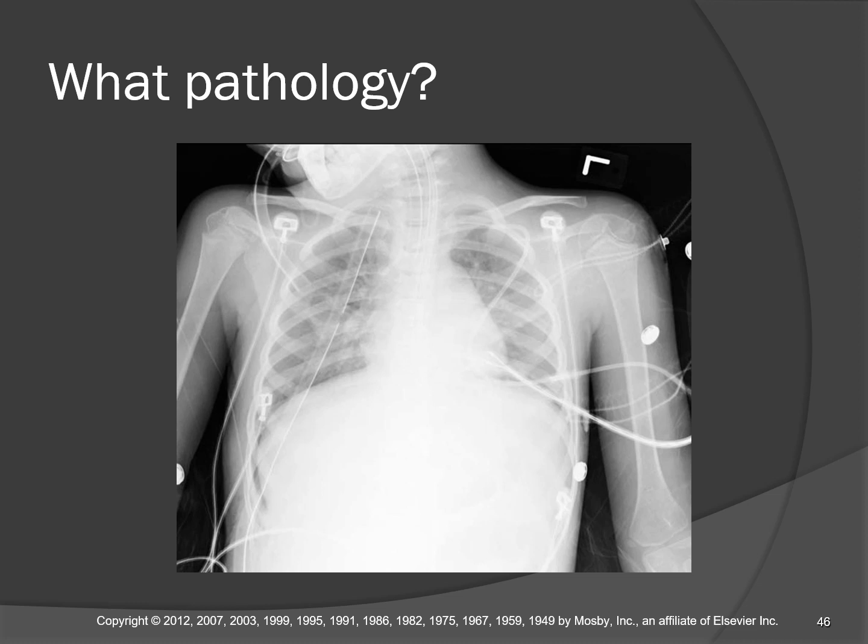So that air is pushing the liver away from the rib cage, which is a pretty good feat in itself. The chest tube needs to be positioned differently, or the patient needs to be turned, because if the chest tube is applying suction, it's ineffective all the way up there in the apex of the lung.